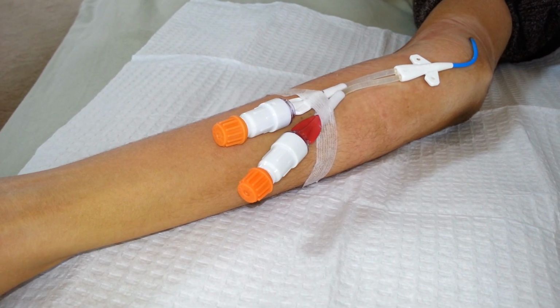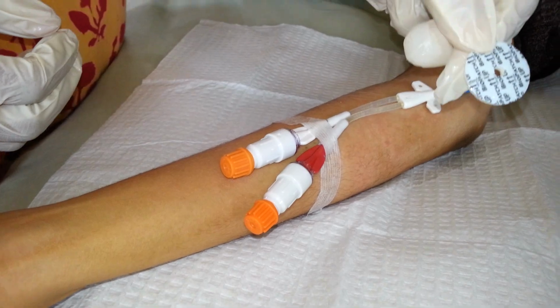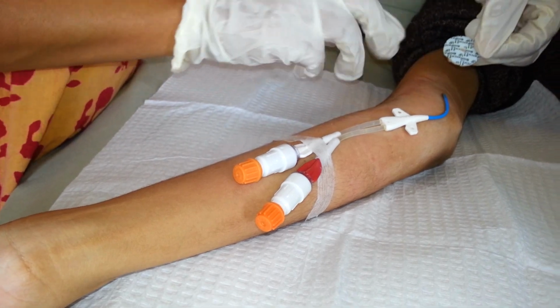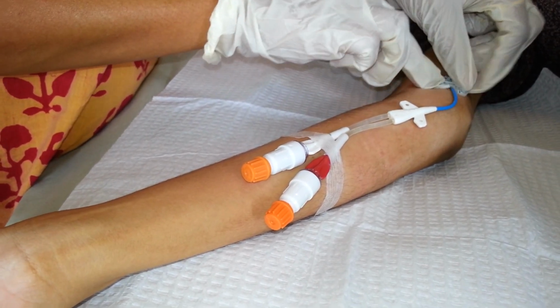After that, we'll put the Biopatch. The key to putting the Biopatch correctly is to align the slit of the Biopatch with the length of the catheter or at a 30-degree angle. We align it with the length.